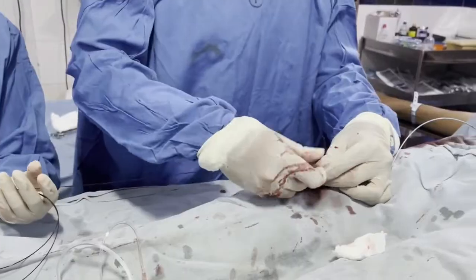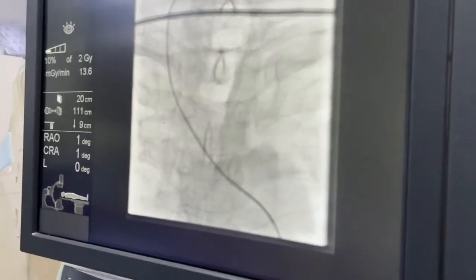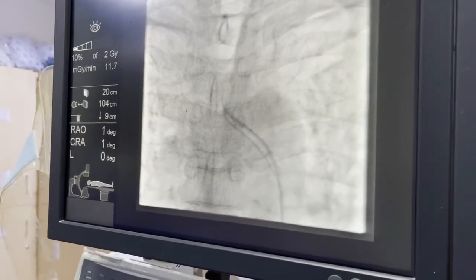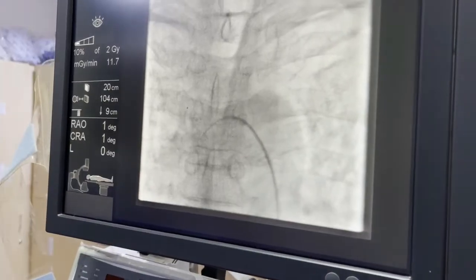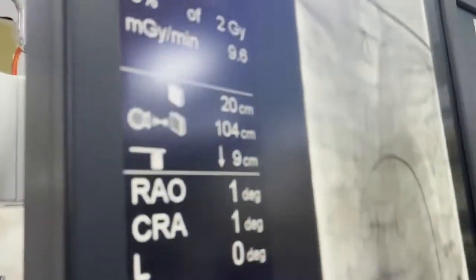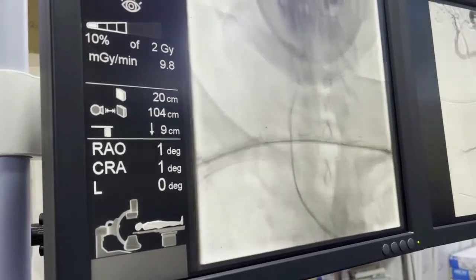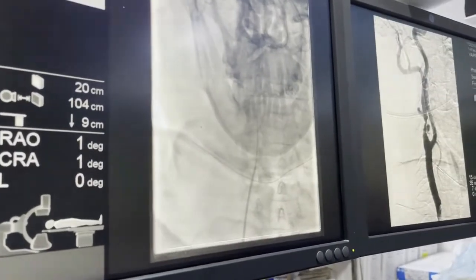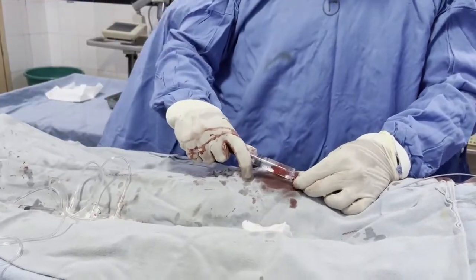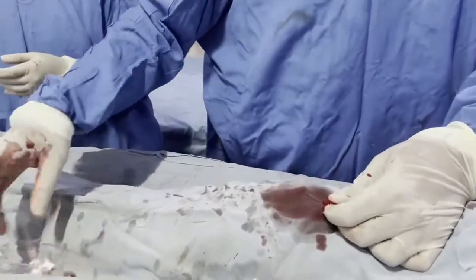This is the double flush technique: first we take blood back, then with a second syringe we take half blood and inject it back. The O35 wire has been reinserted because we have to change the position. I am withdrawing it back to the brachiocephalic trunk and trying to shift to the left common carotid artery, but it keeps going directly into the right CCA. It has jumped into the right vertebral artery — going from the right brachiocephalic trunk to the right subclavian and directly entering the right vertebral artery. Every two minutes we must do double flushing, because the wire, catheter, and other foreign bodies can cause clots in between.